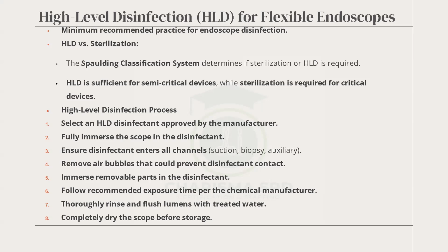Therefore, it is exposed to the outside environment and needs to be reprocessed. So some is 7 days. Most of the time, high-level disinfectant is 7 days. Then you have to reprocess it again. So you always see them having expiration dates on them. They tag them the day it was processed, and then they count 7 days from that time.